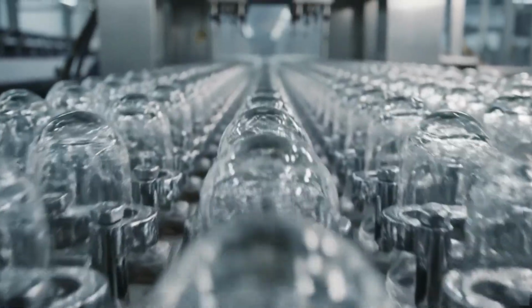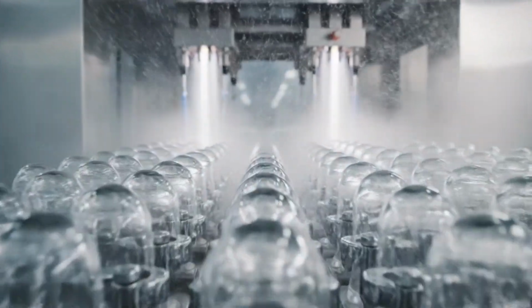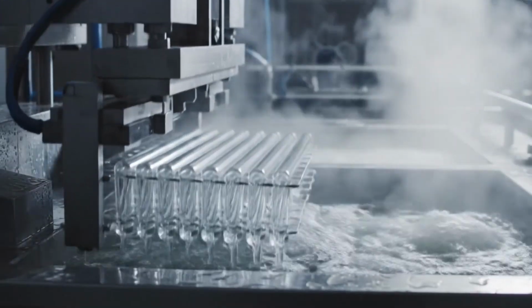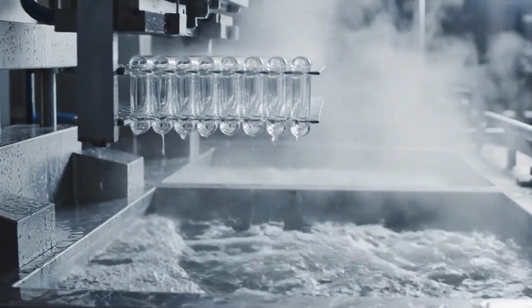Precision begins with the mold. These glass formers are the blueprint for every single condom produced. Total sterilization is mandatory. Even a single speck of dust can cause a pinhole defect in the final product.